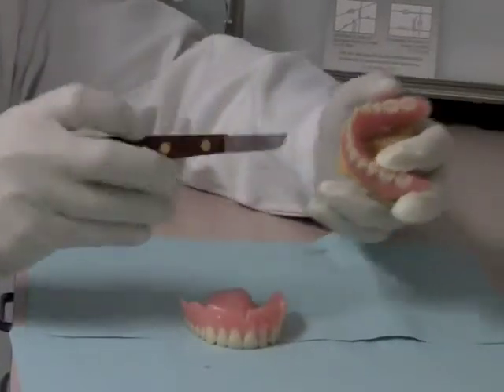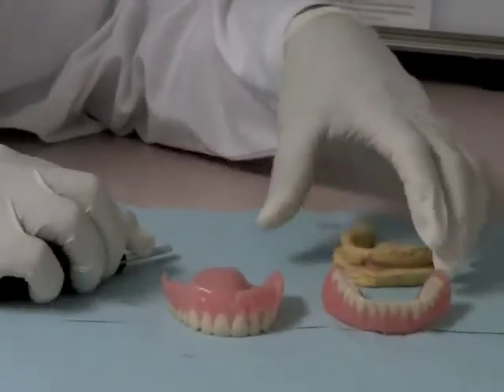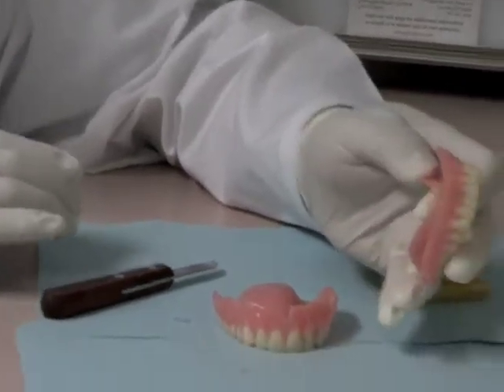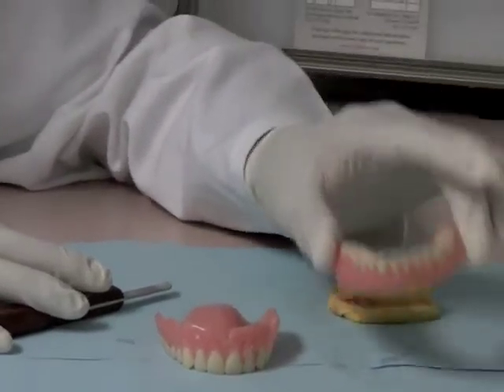So what I got to do now is I have to pry this off the model so I can polish everything up, and you can see how my whole denture now is stuck together. It's all one piece again, and now I got to polish and trim it up. We're getting close to the end.